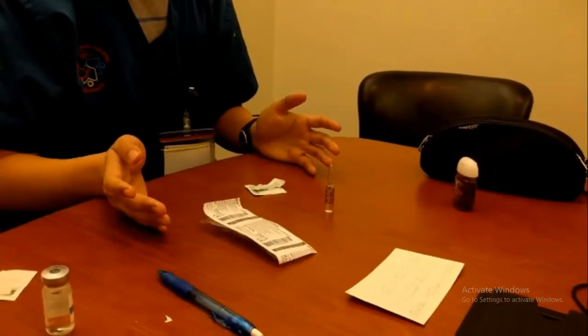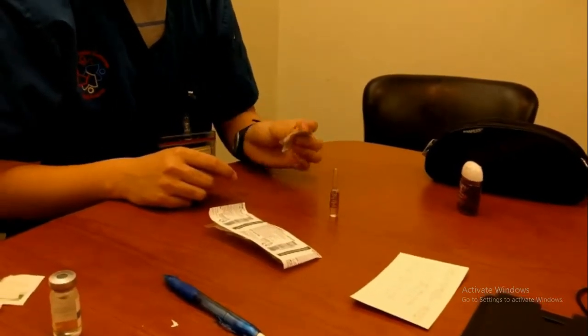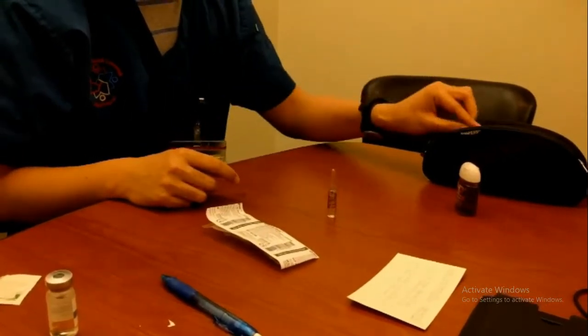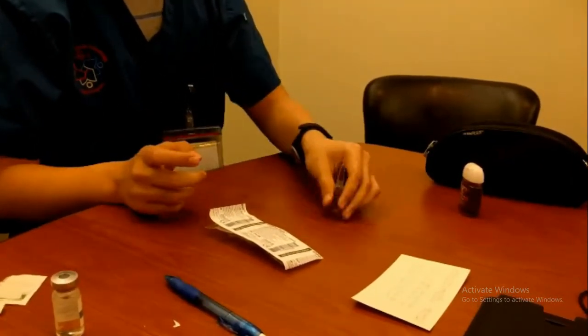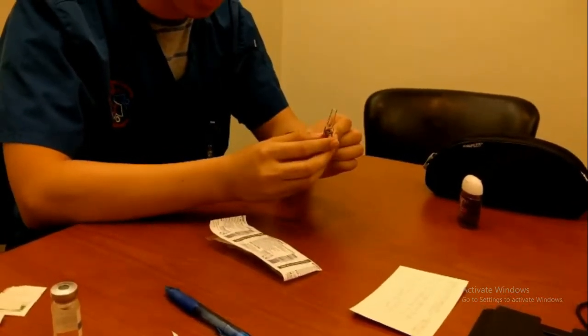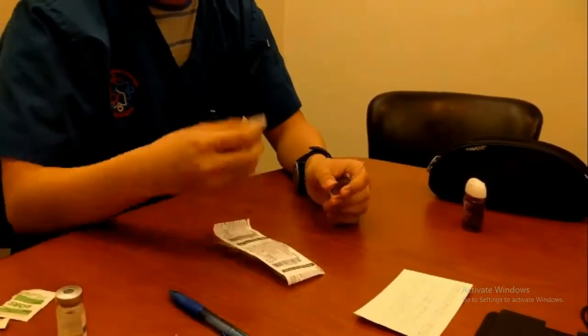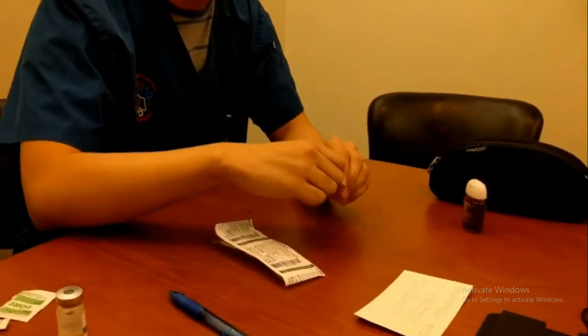Alright, before I start the intramuscular injection preparation, I'm going to be taking my garbage from the previous subcutaneous injection and just putting it in the trash, because it does not need to be in the sharps container. Alright, so first I'm going to start by viewing the ampule, making sure that none of the liquid is in the neck, and then I'm going to be taking an alcohol swab and just making sure that I put it around it while I break it.